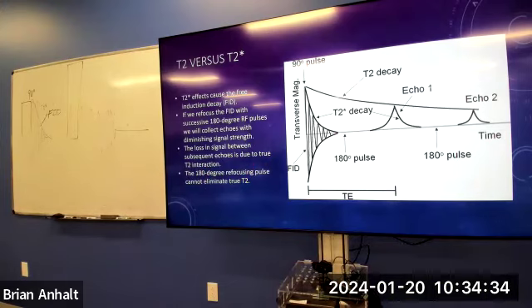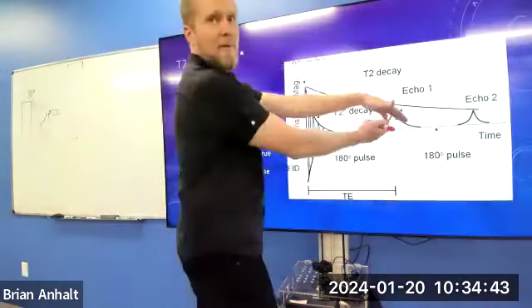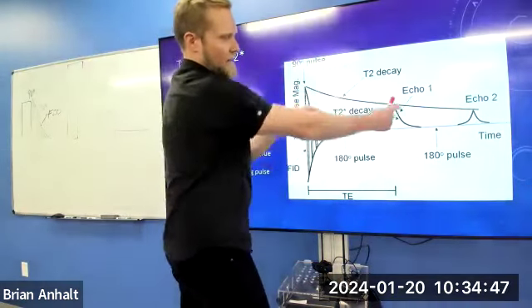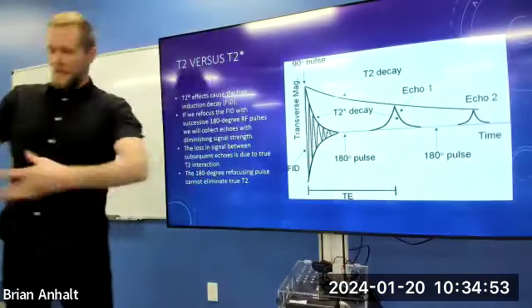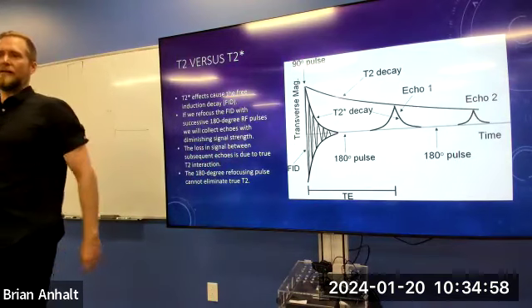And that is great for MRI because we're able to now get T2 contrast. Because not every tissue is going to decay at this rate. Remember, we have different T2 decay times. Some tissues, if we have a TE here, will be weak signal. Other ones will still have a lot of signal because their molecules are further apart and they weren't reacting with each other as fast, right?